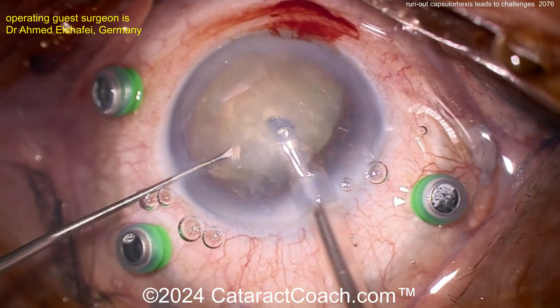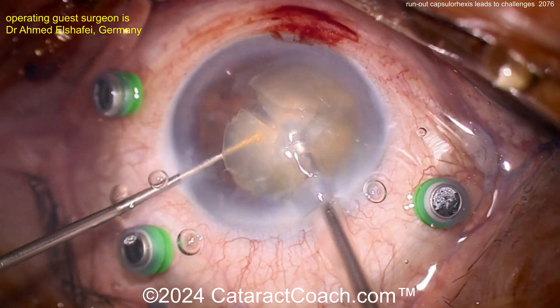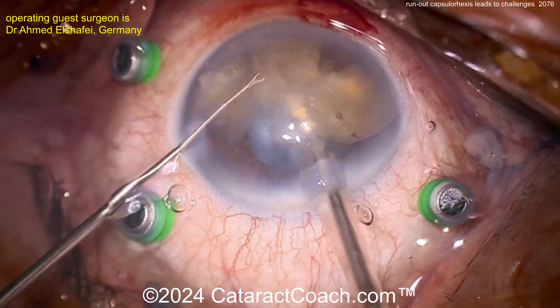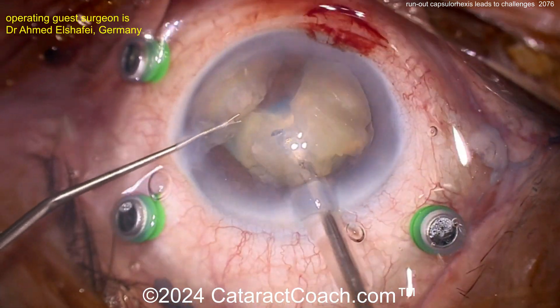Here comes the phaco probe. Luckily, not too dense of a cataract — opaque yes, but not that dense. Chopping up into pieces here and just aspirating in the anterior chamber. Let's take a look and see what happens.